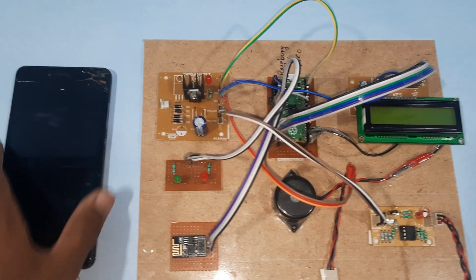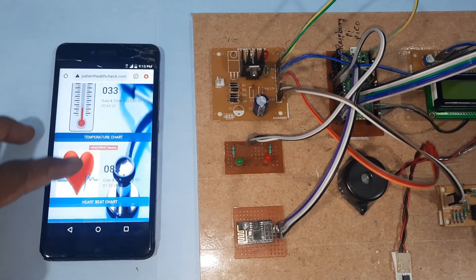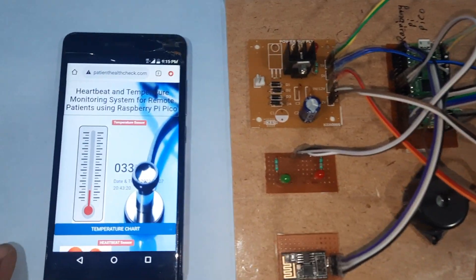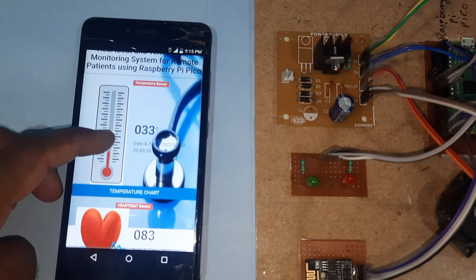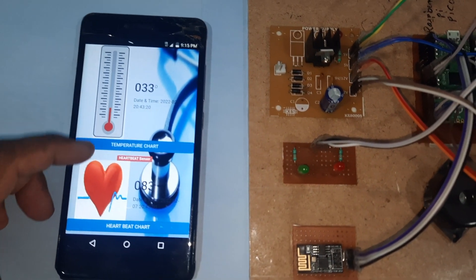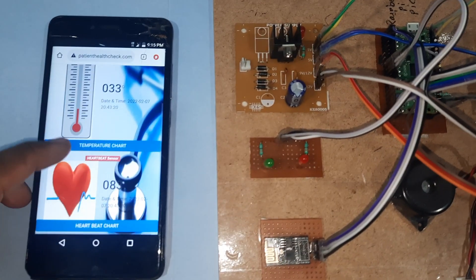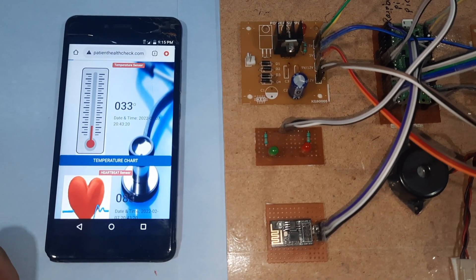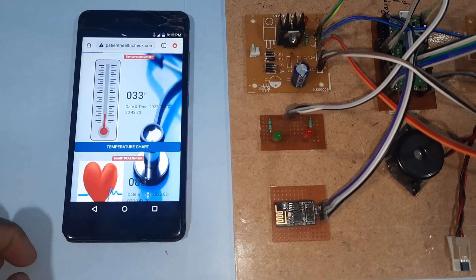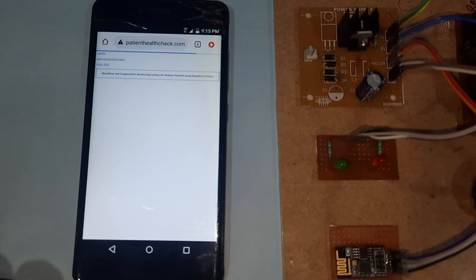Hi, we are from SVS Embedded. The project title is Heartbeat and Temperature Monitoring System for Remote Patients using Raspberry Pi Pico, temperature sensor, and heartbeat sensor. We can monitor the temperature graphs and full data.